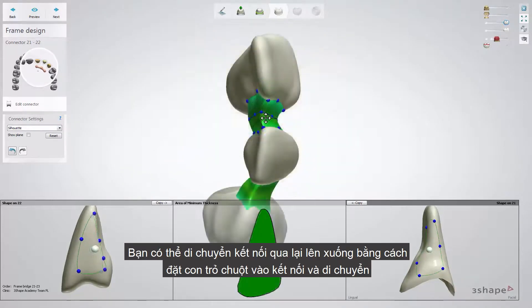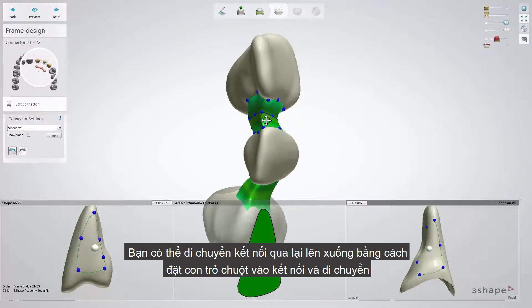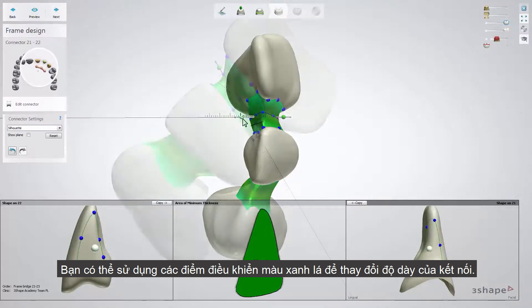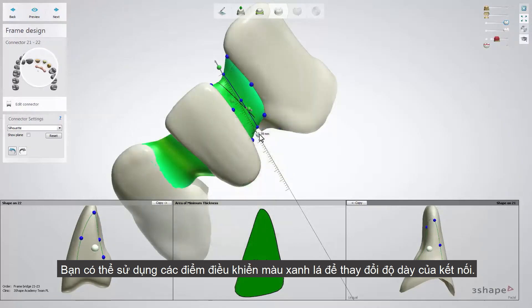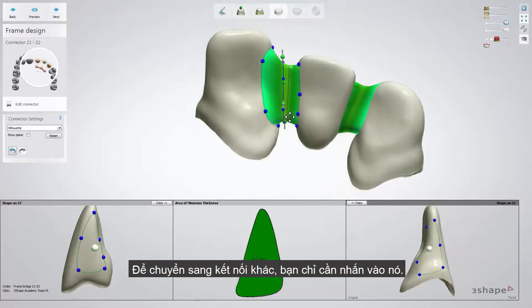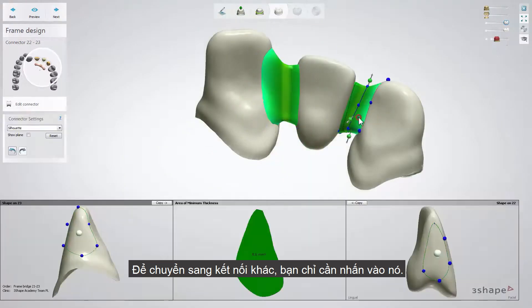You can move the mouse over the connector until the cursor turns into a four-headed arrow to drag the whole connector. While your mouse is on the connector, you can also use green control points to modify the connector's thickness. For this, click on one of the points and drag it up or down. To switch to another connector, simply click on it.